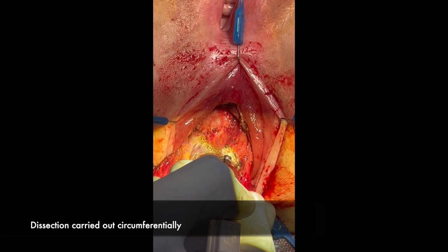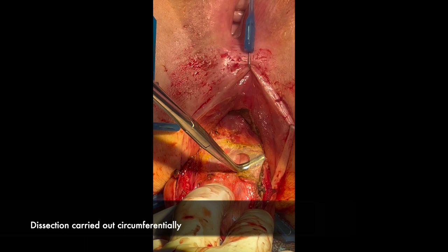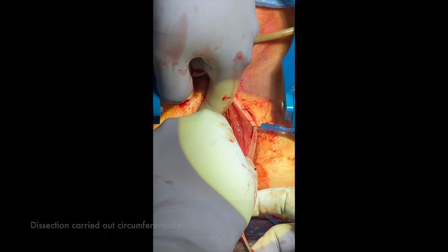A full thickness incision is then made into the peritoneal cavity. It is important to note that at this point there may be loops of small bowel in the pelvis and hence careful dissection is required to avoid inadvertent injury.